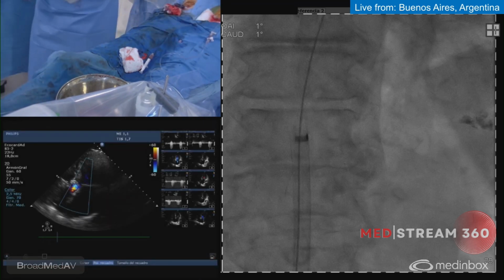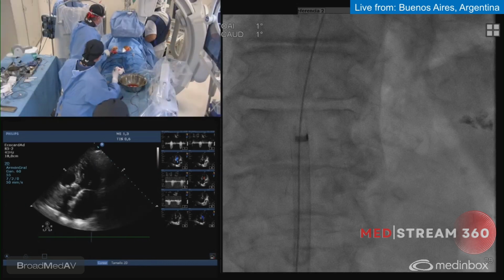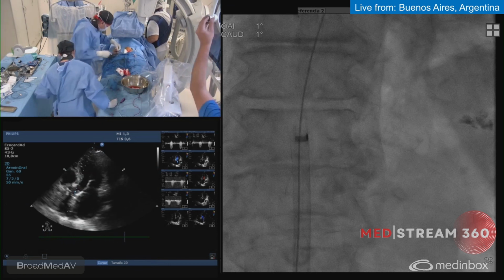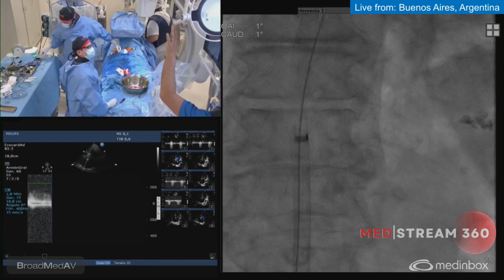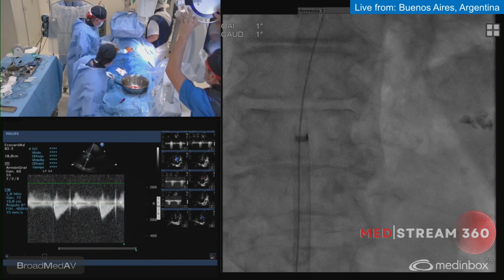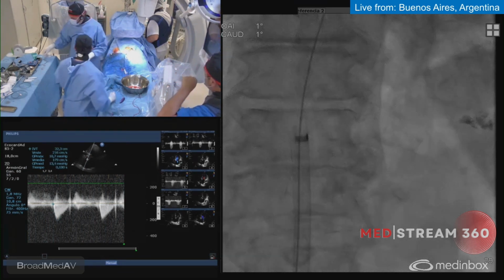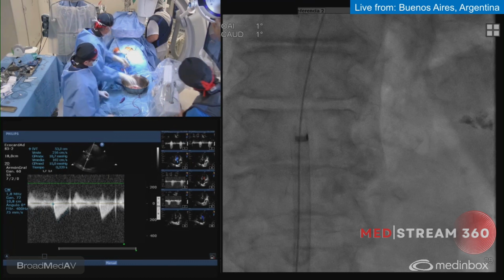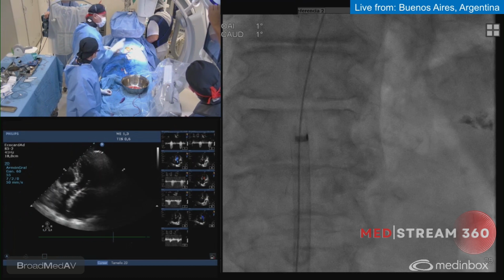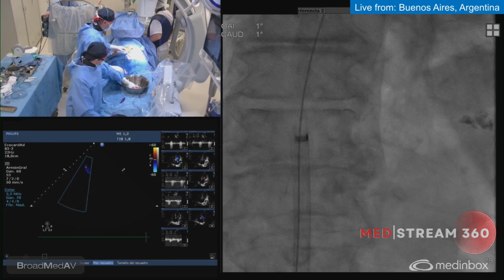So Joaquin, 6 French, give me some light here. Any other question, Andres? We have used only one ProGlide because we did an echo-guided puncture. It's almost a normal femoral artery, huge. It is supposed to be sealed quite easily. Here is okay, because if not, we are destroying the image. Moving the table. Come here, Joaquin.